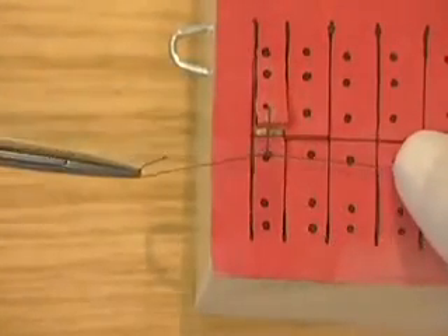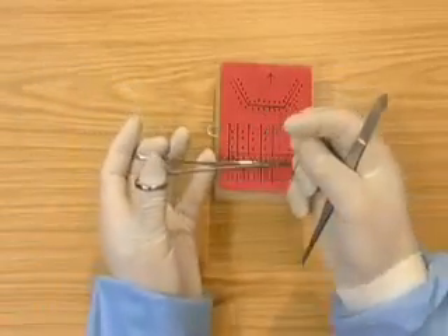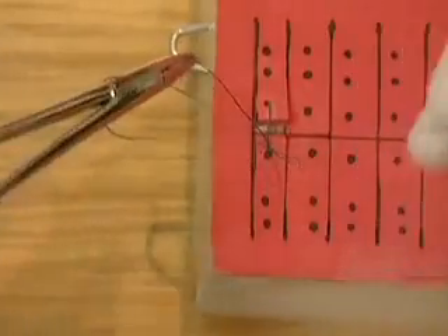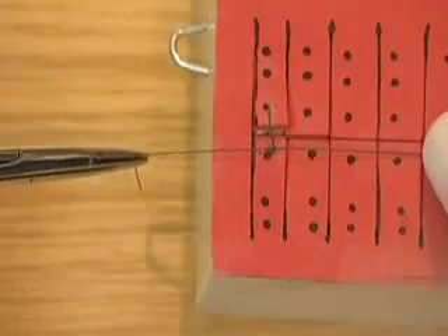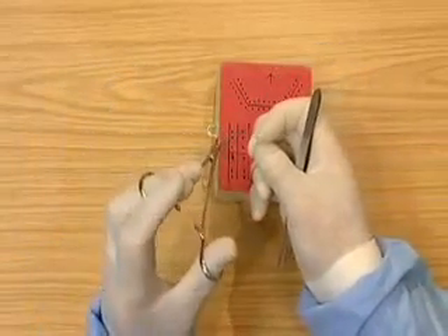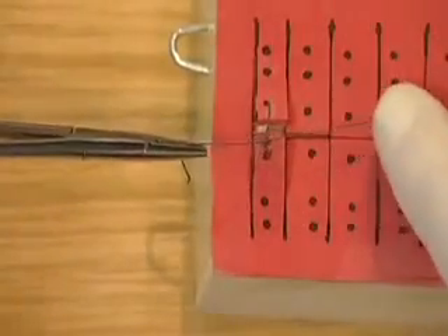Tightening the knot using the first finger. Then going underneath, pulling it tight. Then over once, holding, pulling, and presenting the suture.